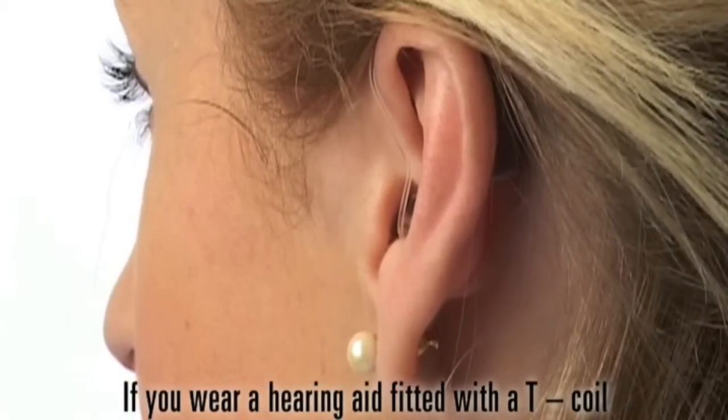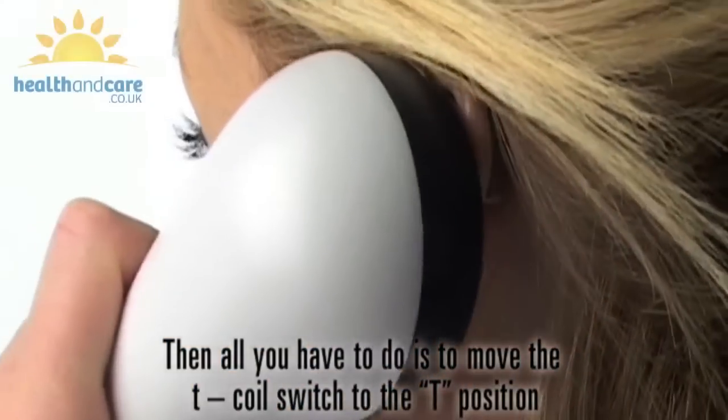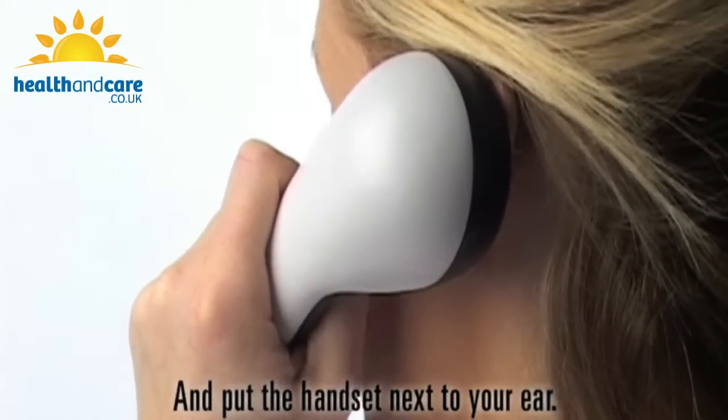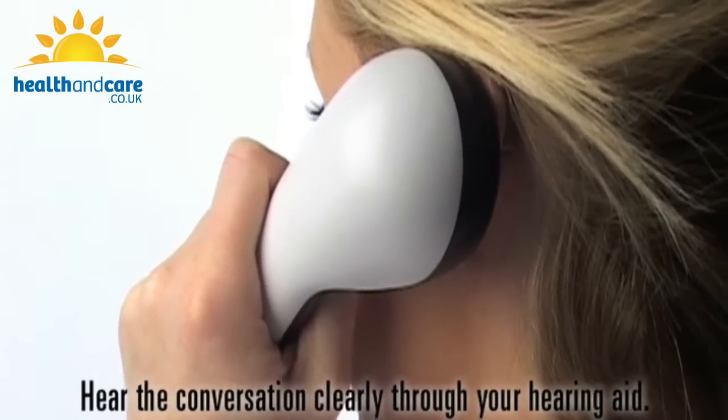If you wear a hearing aid fitted with a T-coil, all you have to do is move the T-coil switch to the T position and put the handset next to your ear. Hear the conversation clearly through your hearing aid.